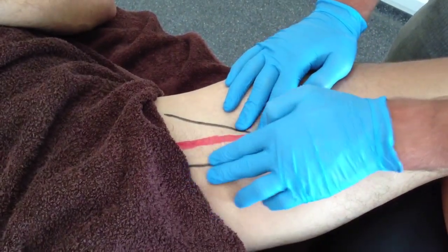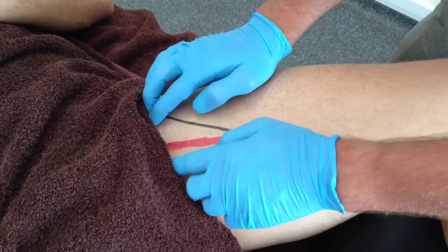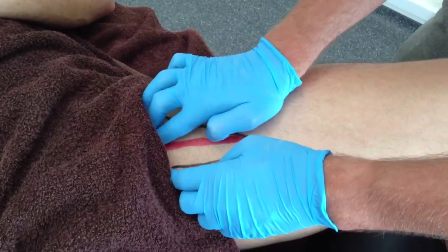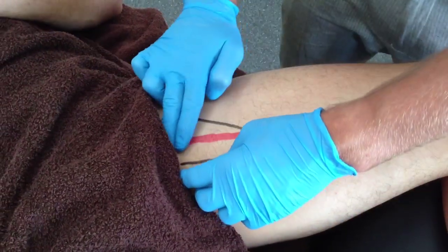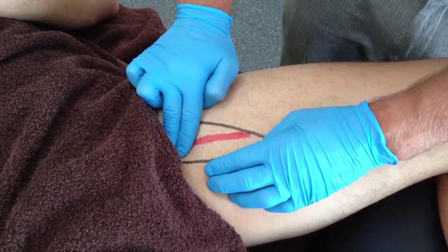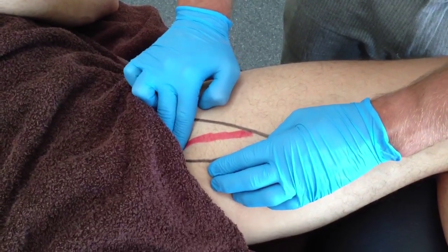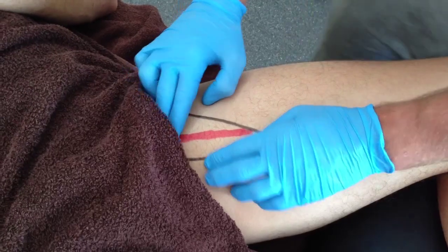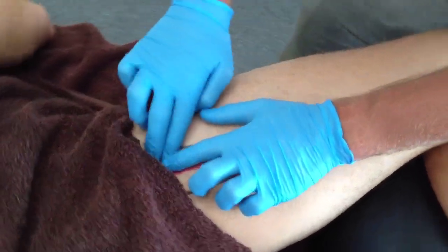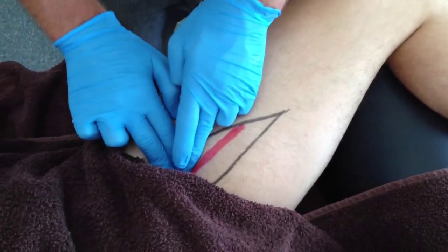First, palpate along the sartorius for the lateral aspect, followed by the adductor longus down the medial aspect. Locate the inguinal ligament across the superior border, followed by the femoral artery within the triangle. Following accurate palpation of this femoral artery, the practitioner then palpates a finger width laterally and then palpates for the trigger points of the iliopsoas.